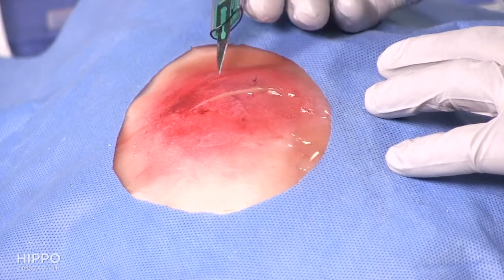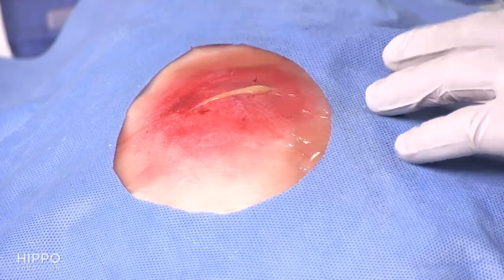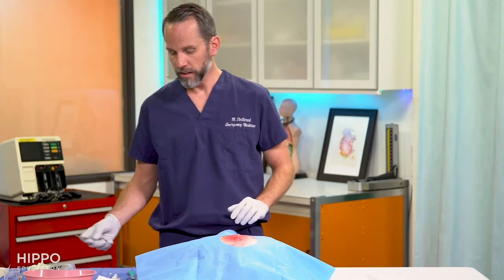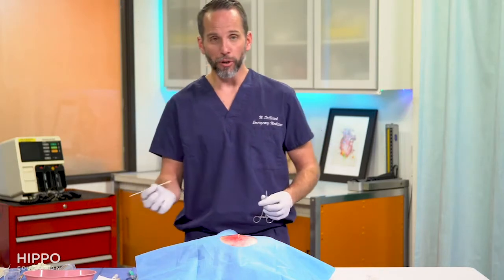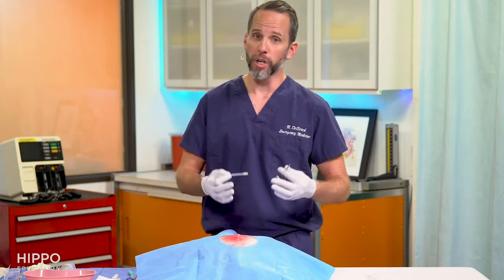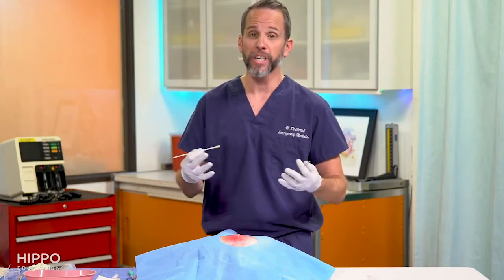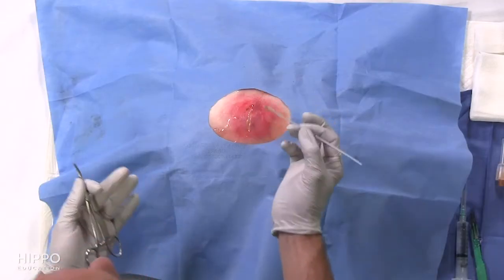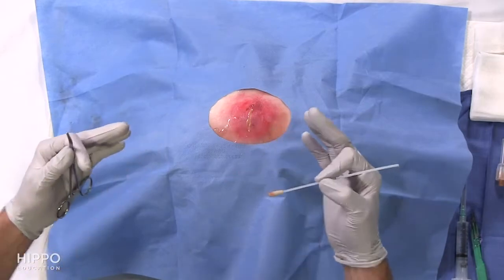And you know that you're in the abscess when you start having that purulent material and fluid coming out. Putting your blade away, the next step is you don't always have to culture abscesses, but if this is a complex infection or an immunocompromised patient or a recurrent abscess, sometimes culturing this purulent material is going to help you narrow down your antibiotic choices.